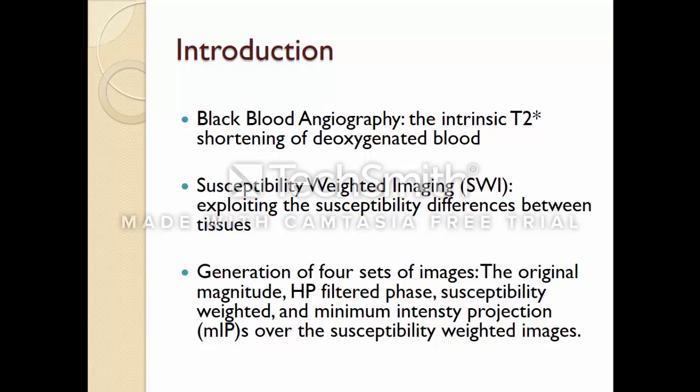So susceptibility weighted imaging is actually a new type of contrast in MR imaging. It is quite different from spin density, T1 or T2 imaging. SWI uses a fully velocity compensated three-dimensional RF spoiled high-resolution 3D gradient echo scan. This method exploits the susceptibility differences between neighboring tissues. And in order to manifest this contrast, the signal detects substances with different susceptibilities than the neighboring tissues, such as venous blood, hemorrhage, or iron storage.